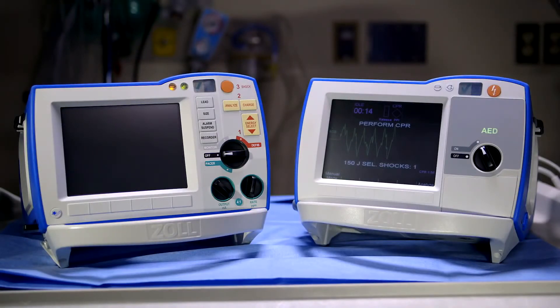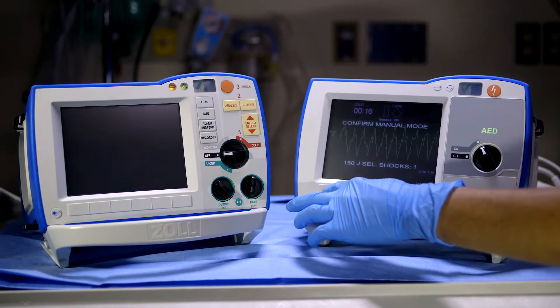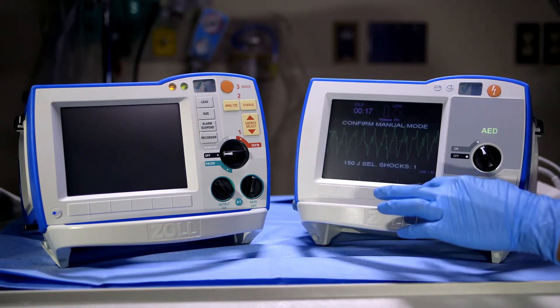To convert to manual mode, press the manual soft key on the lower left-hand corner. Depending on your institution's settings, you may need to press confirm.